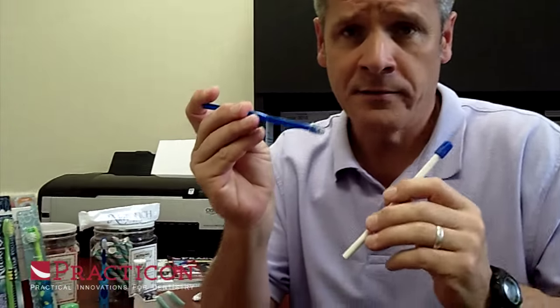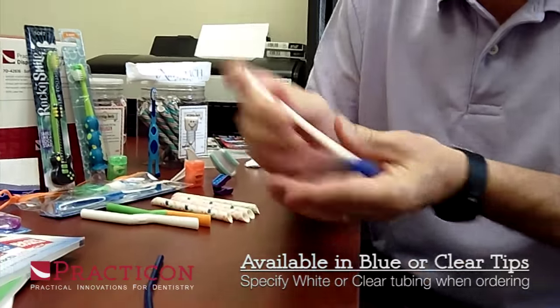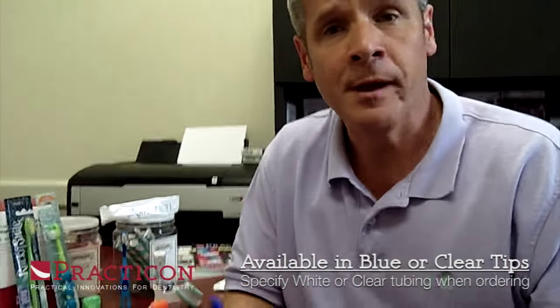Let me compare it to a typical hard plastic saliva ejector. Listen to the difference — how that sounds on the table versus this. Such a difference. See the flexibility and the softness? That's going to make a great difference in their mouth and make a happier patient.